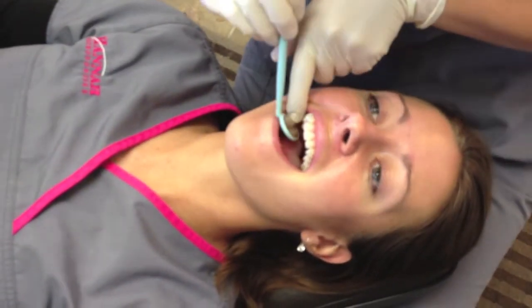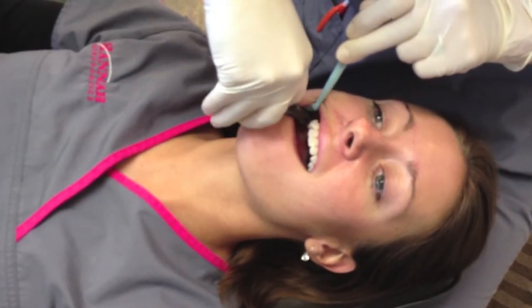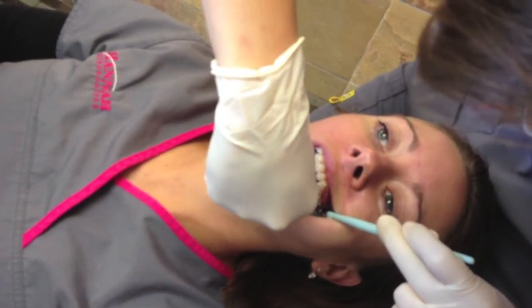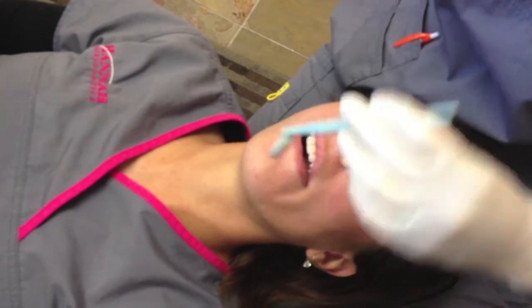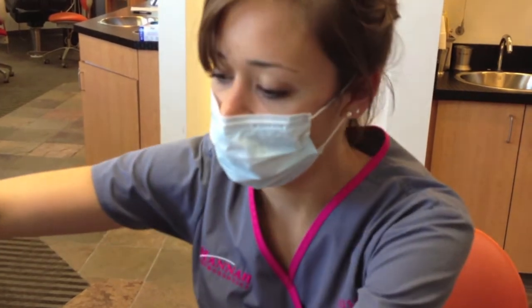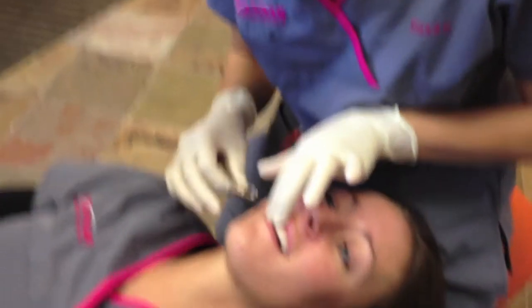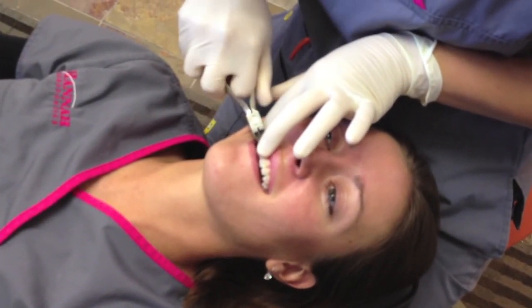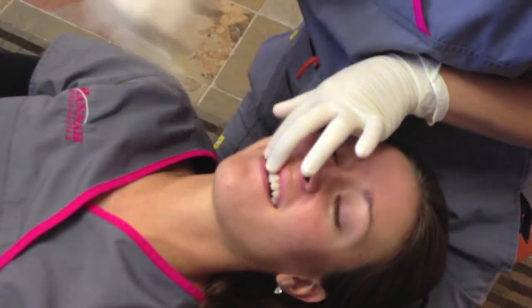I'm gonna look at the back here again and clip all the excess wire. We're gonna put a little stop on the wire — it's just a little teeny tiny crimpable stop. This is gonna keep the wire from sliding around and causing her to come back in for appointments. Even though she works here, she can easily get it out. Just a little stop.